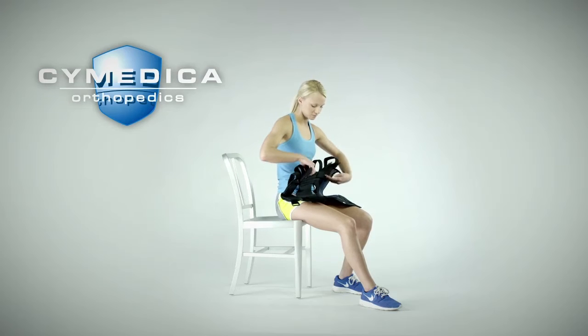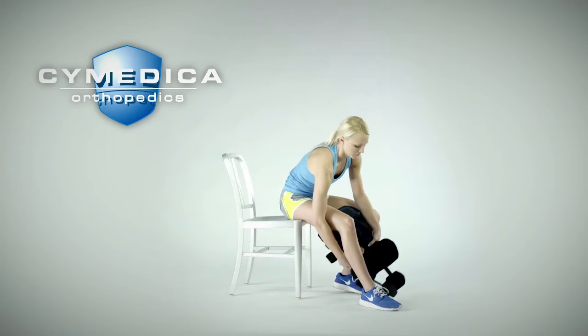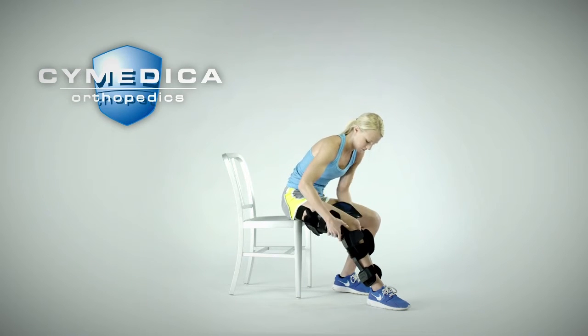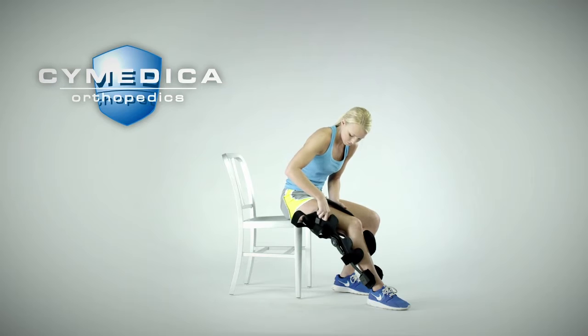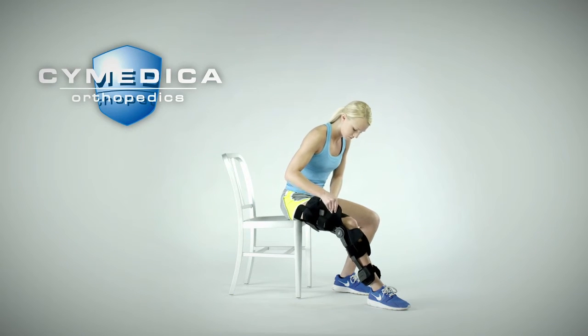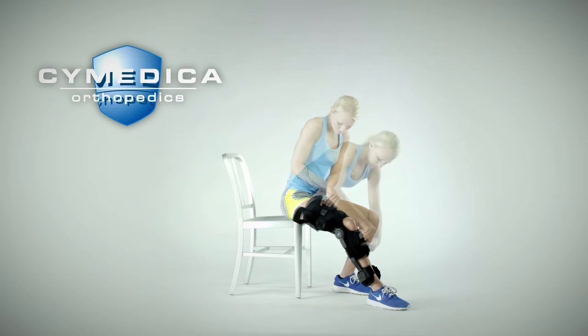Take the conductive garment with post-operative brace out of the box and sit on the floor or chair with the injured leg extended. Place the garment underneath the leg with the hole position behind the knee and the blue surface under the thigh. Wrap the garment around the top of the thigh starting with the inside thigh panel. Loosely secure the three wrap ends on the thigh portion, then the two wrap ends on the calf portion.